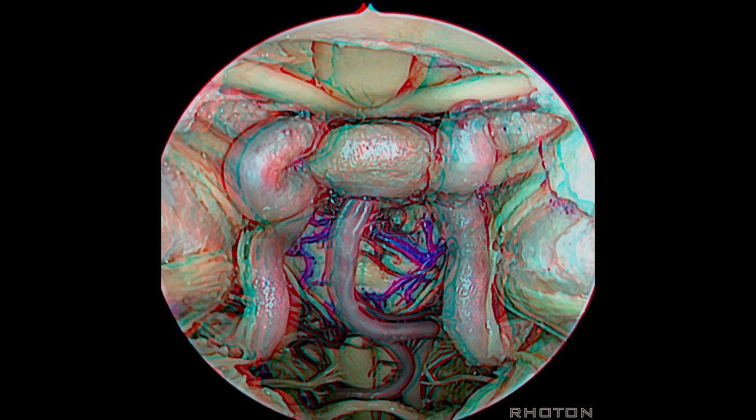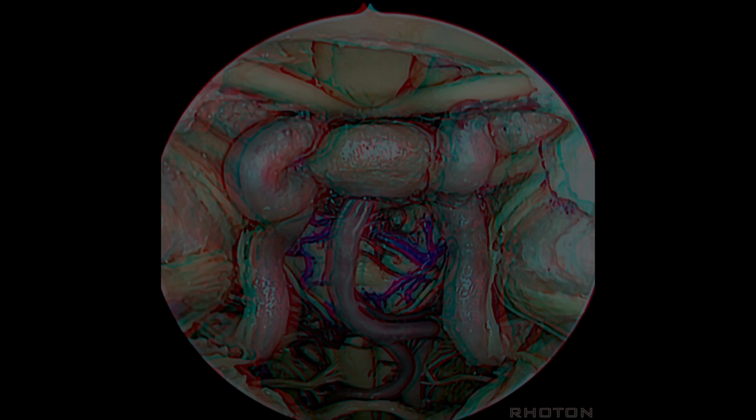And then you can resect the ligaments, and you have the tectorial membrane that crosses the foramen magnum, attaches to the clivus, the atlanto-occipital joints laterally, so that with the transnasal approach, you get access to all of this area.